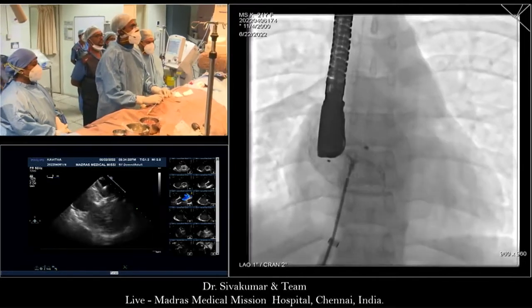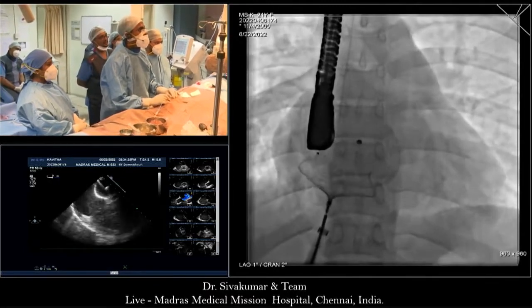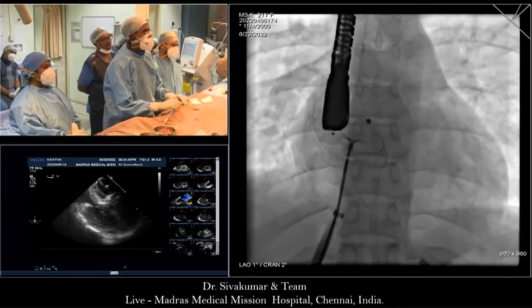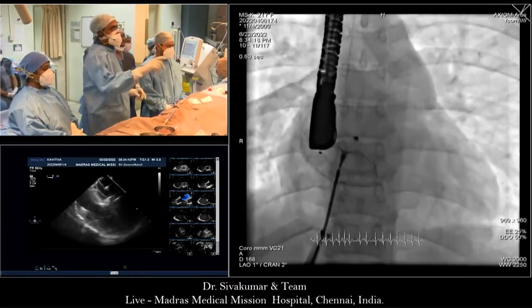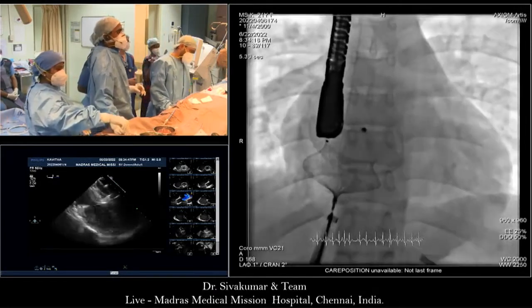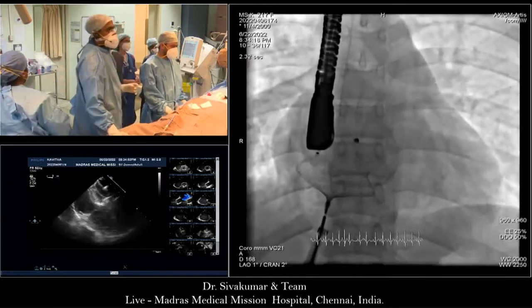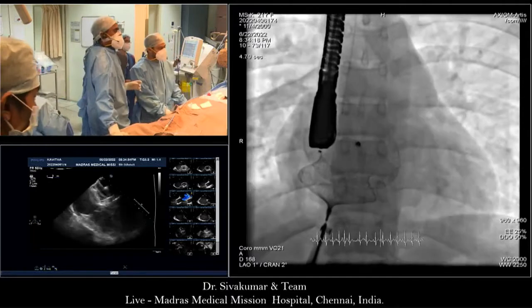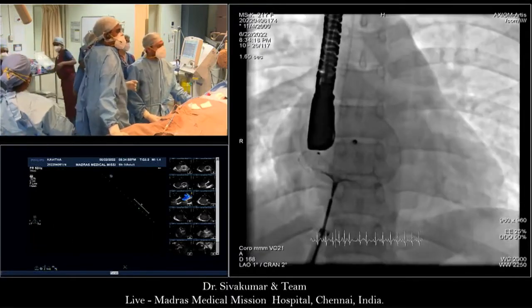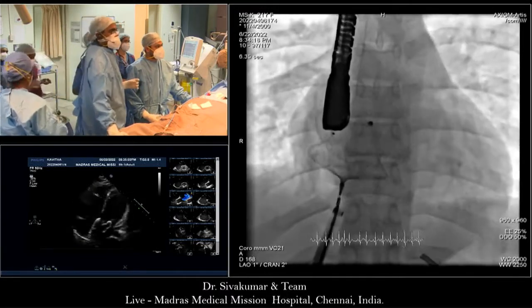Siva, on transthoracic, again you put color there, close to the left atrial disc, because I saw some flow close to the left atrial disc on transthoracic. No, actually there is no flow, Bharat. But do a flow towards the disc, on the LA disc. You are showing transthoracic, Srija? Okay. I did a wiggle in between.